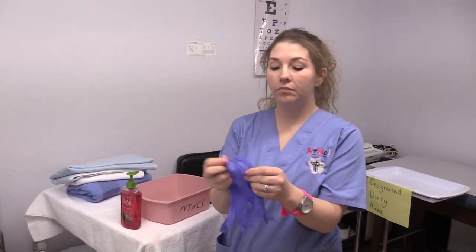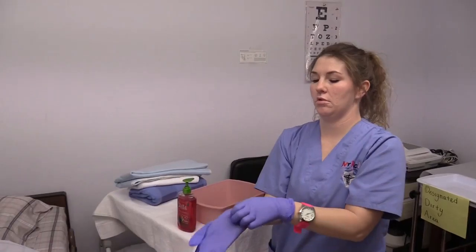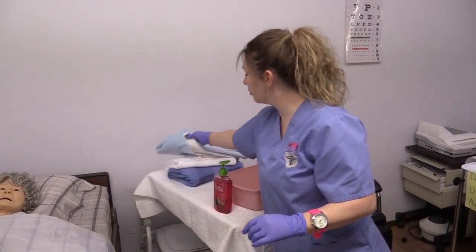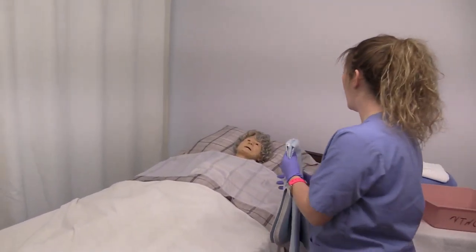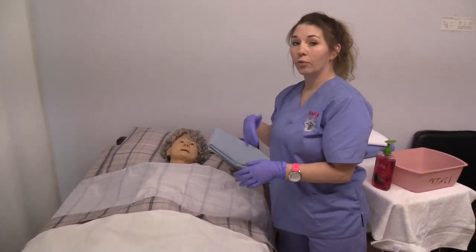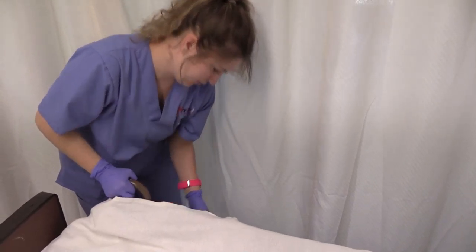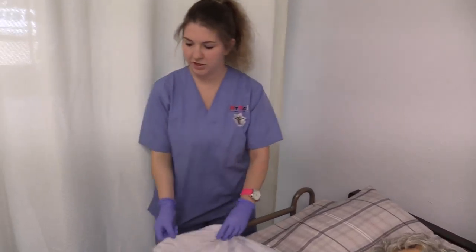Now I will begin the skill by putting my gloves on — putting your less dominant hand on first, then your dominant hand. I am now going to place the pad or chuck underneath the resident to make sure we do not get the bed wet. I'm going to walk over to the other side, raise up the bed rail, and then we will begin rolling her over to place the pad, making sure the bed rail is raised so the patient doesn't fall out.